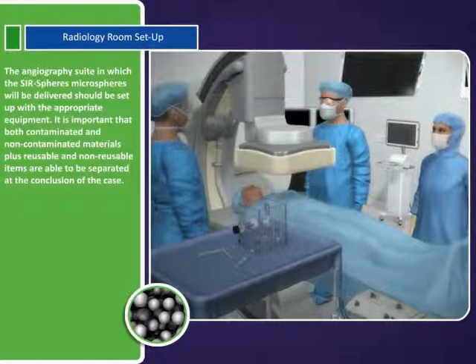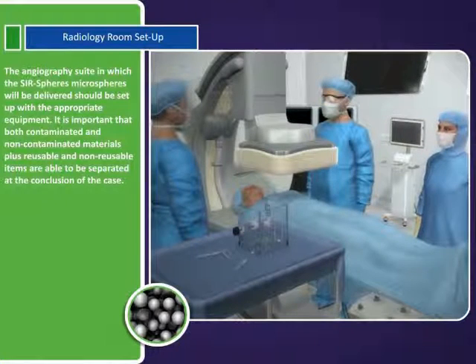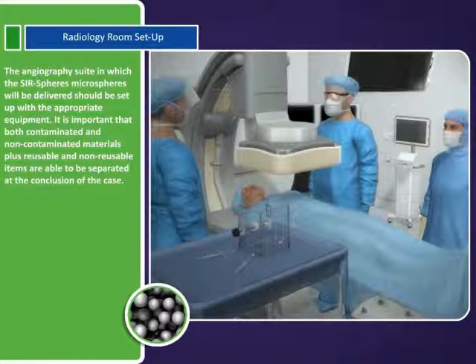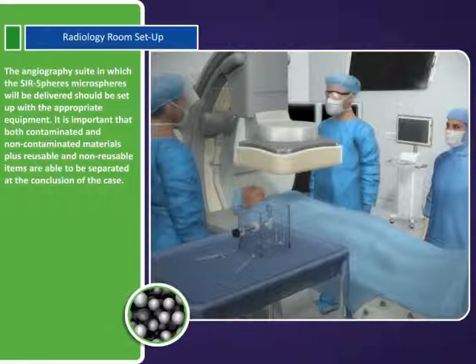The angiography suite in which the SurSpheres microspheres will be delivered should be set up with the appropriate equipment. It is important that both contaminated and non-contaminated materials, plus reusable and non-reusable items, are able to be separated at the conclusion of the case.